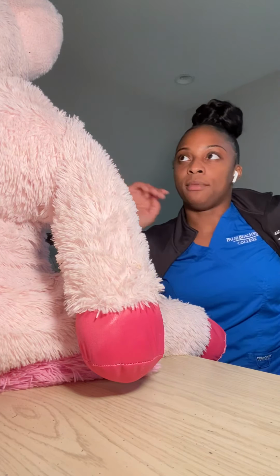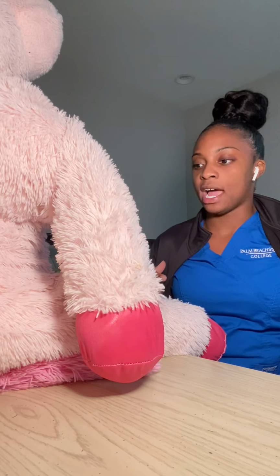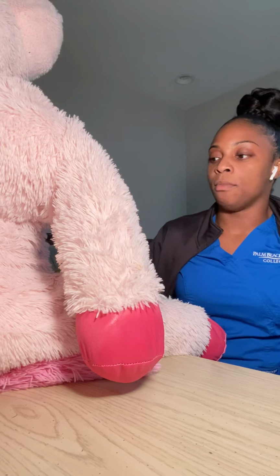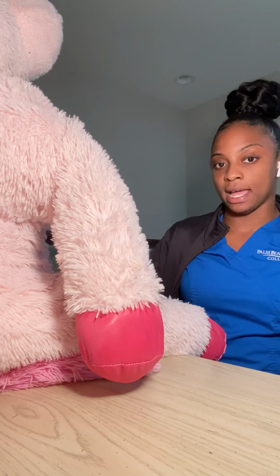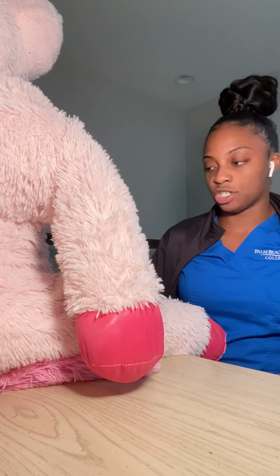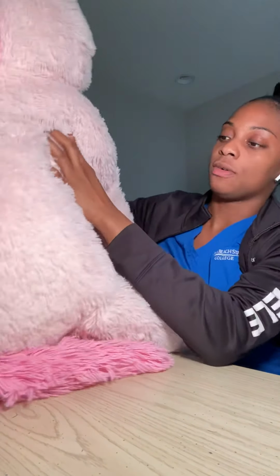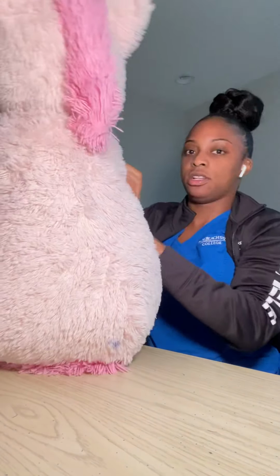At this point, I would have all of my labs, make sure I have a CBC done, white blood cell count done, all before I get my epidural inserted into the patient. She's going to be sitting up on the bedside, which I have her doing. The doctor's going to go ahead and I'm going to turn her this way.